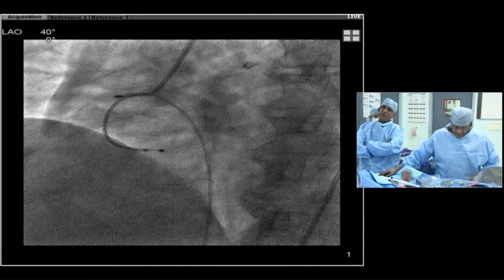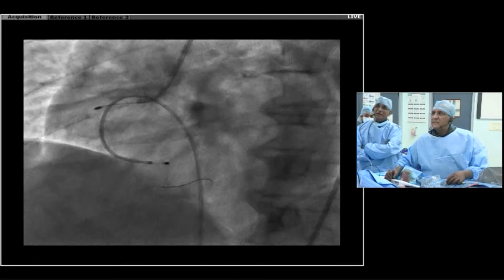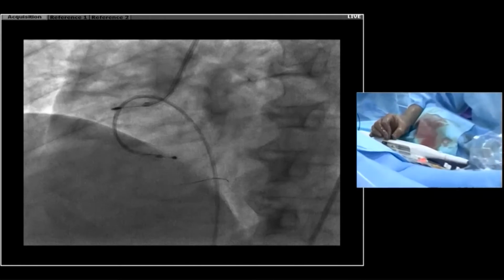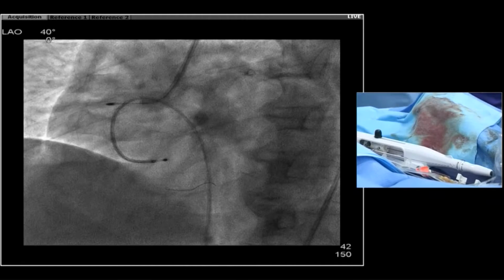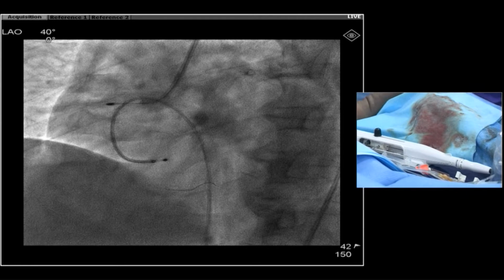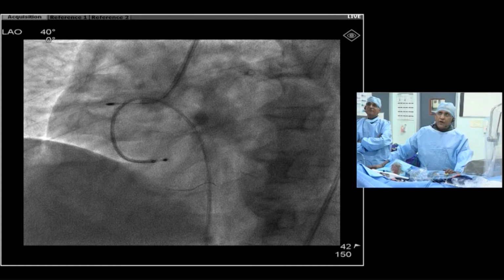The Japanese study shows that debulking is better at slower speeds, but for crossability you probably still need a higher speed. Yeah, that's everybody's experience too, that you sometimes have to go very high to cross. Now we think we have crossed, so we have slowed down. Now we're going to do a 120,000 run on the same, waiting for our pacing wire; you saw that it's going on to pacing.